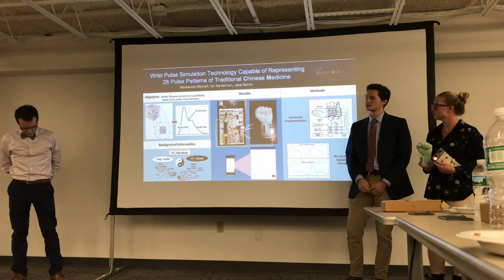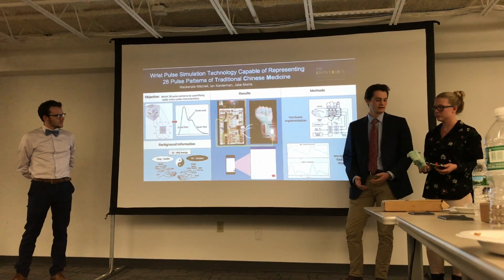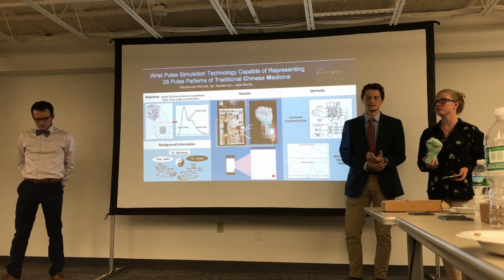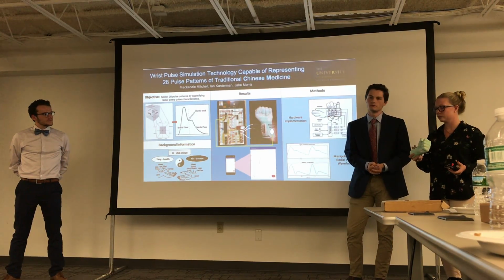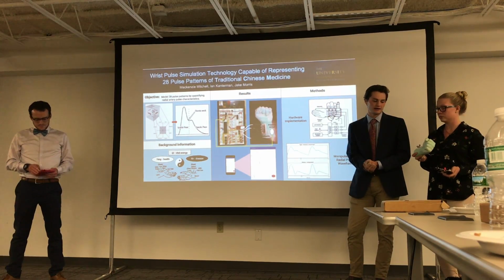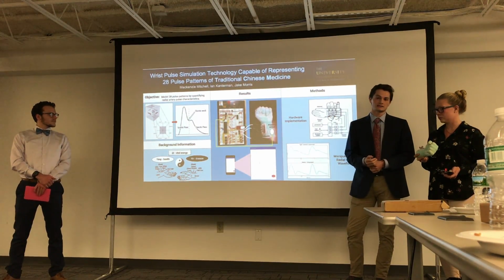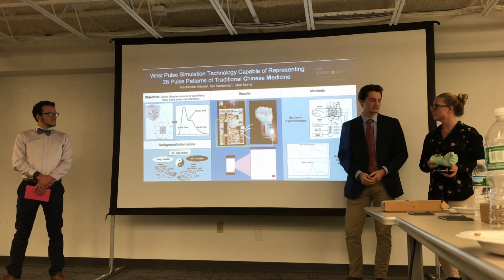We want a finely tuned, polished product, so to improve the hardware we're planning to recreate the existing hand model by making it more realistic. We're going to make another mold with a different type of plaster, in the color of your skin. We are going to redesign the box that contains the 3 solenoids to make it smaller and more compact.